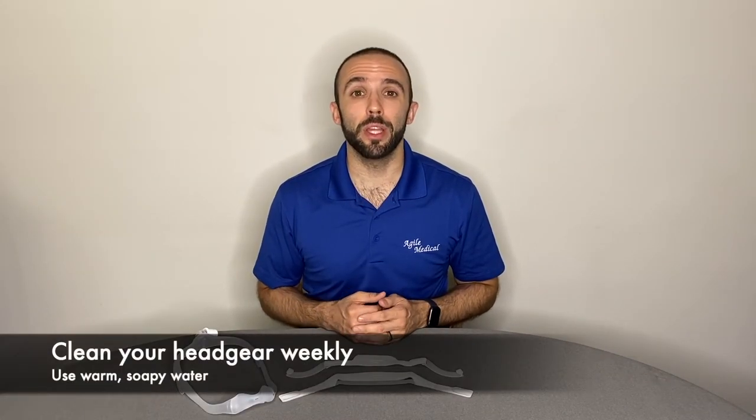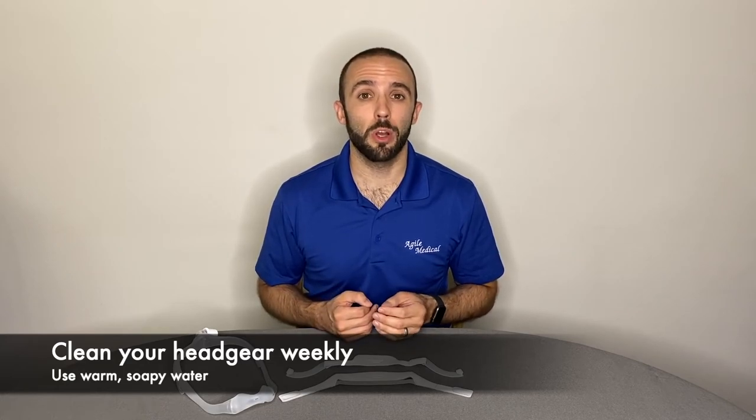CPAP headgear should be disconnected from the mask and hand washed every week with a mild soap or dishwasher detergent and warm water. Let it air dry completely before reattaching it to your mask.